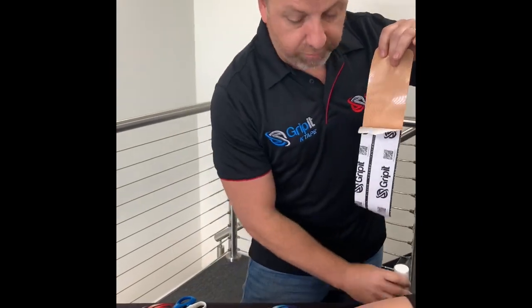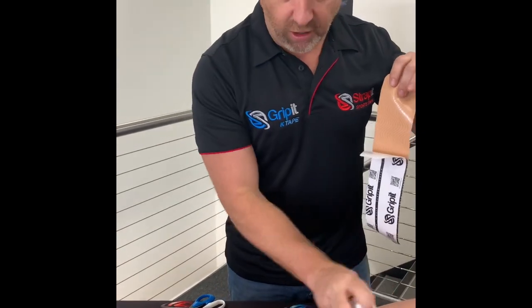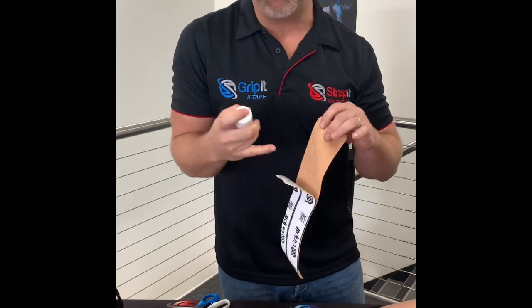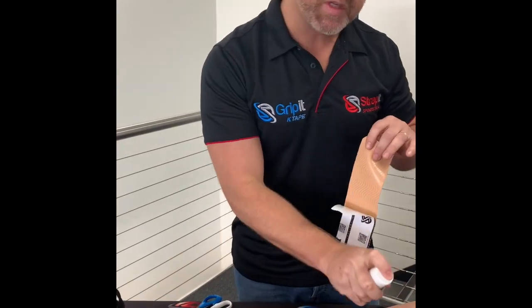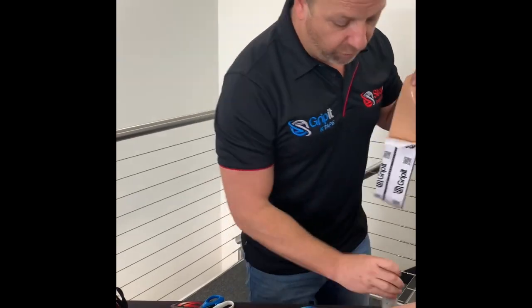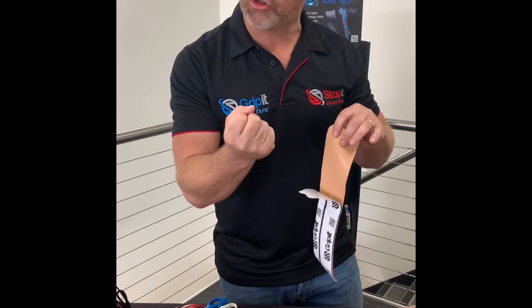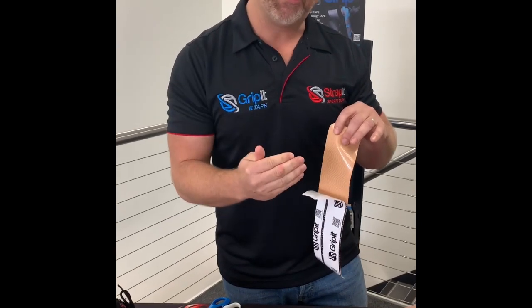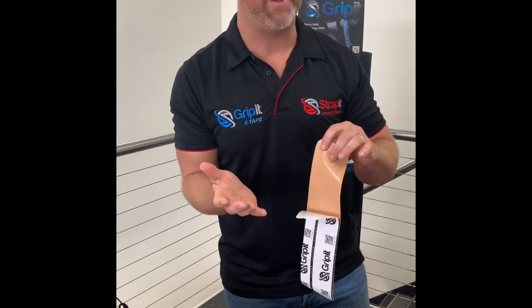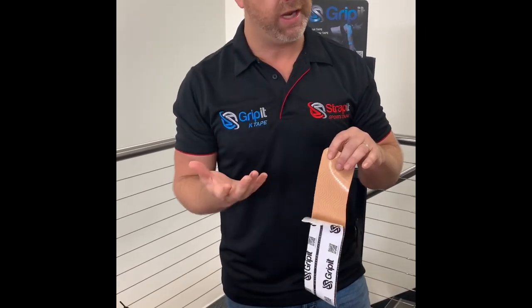When I'm preparing, I can also use a form of spray adhesive. If I have an athlete that's in a climate that's very sweaty, or I just know they're a big sweater, sometimes I might want to spray the area with tacky pre-adhesive spray, which means that there's a film on there that allows the stick to be a bit stronger and less chance of it coming off. For the weekend warrior and for the person in the clinic, should you be a health professional, it may not be required because the tape is very adhesive itself.